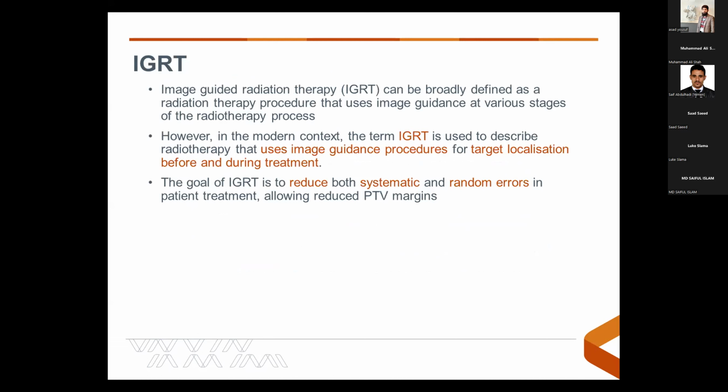All right, so the second part of my presentation is on IGRT. This is a bit shorter than the rest of the presentation, so hopefully I'll have enough time. IGRT is broadly defined as a radiation therapy procedure. Yep, can I have a comment?